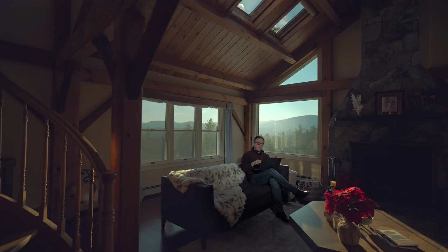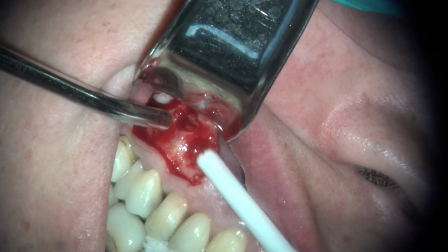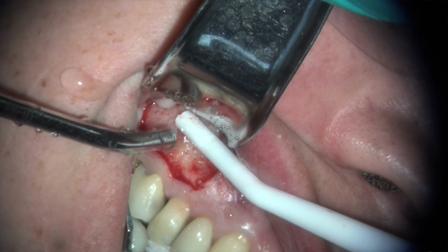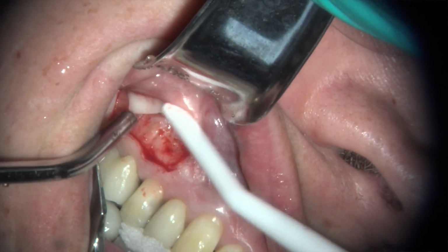But at this point, doing the incision and then reflecting the flap is important, in the sense that we're going to now remove the inflamed tissue for this patient so that we can guarantee the patient is not going to have any additional discomfort in this area. This could have been just an incision and drainage, but since we're going to get down there surgically, we might as well completely enucleate and remove the lesion and perhaps send it out for biopsy so that we can find out if everything is okay.